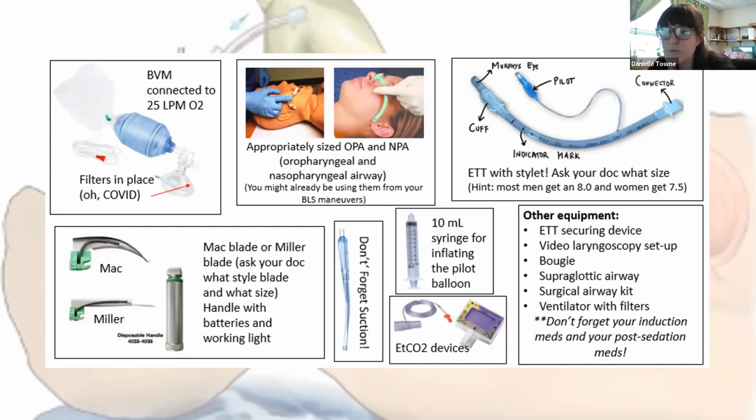The difference there is that you do need to change out that regular stylet that you might have placed for the rigid stylet that's created specifically for video laryngoscopy use. And then that just allows them to manipulate that tube in a more beneficial way because of the hyperangulated video blade. It allows them to have better manipulation. If they use a regular stylet, it can make for an even more challenging intubation.